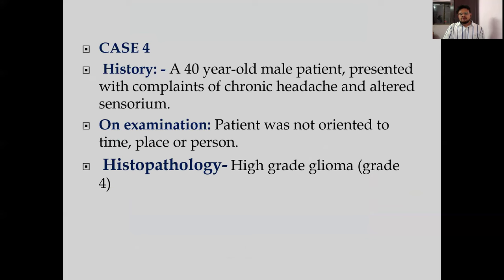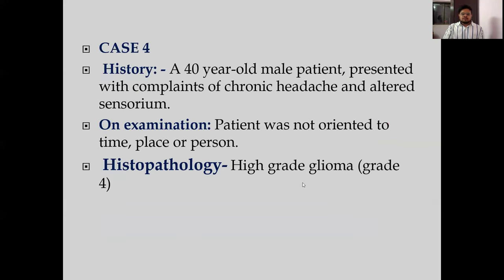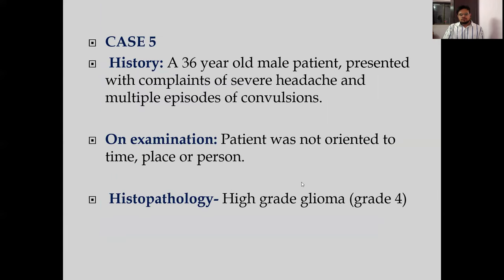Case 4: a 40-year-old male presented with chronic headache and altered sensorium. The patient was not oriented to time, place, or person on examination. Imaging revealed an ill-defined FLAIR hyperintense, focally-enhancing lesion involving the pons, upper half of the medulla oblongata, and bilateral cerebellar peduncles. Fractional anisotropy was reduced, and on tractography we can see there is complete infiltration of the white matter tracts running through it. Histopathology revealed it was a high-grade glioma, grade 4.